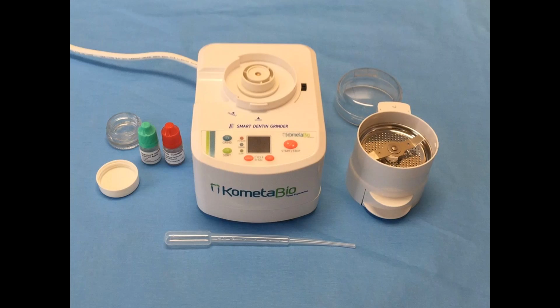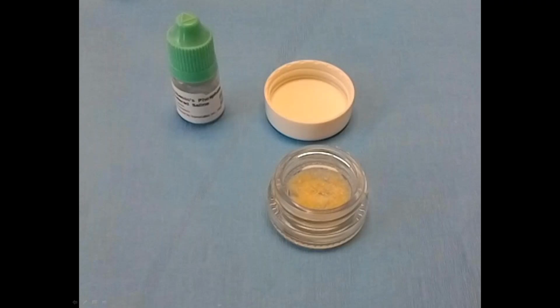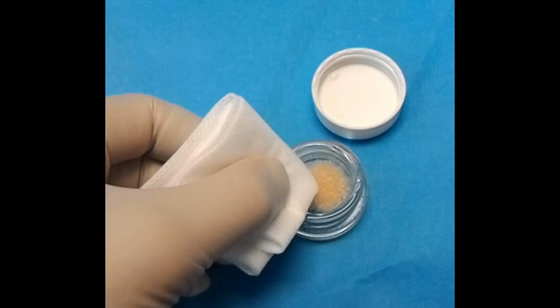Additional graft cleanser, we'll put these in the cleanser for about 10 minutes. And then once the 10 minutes are over, we use phosphate buffer to go ahead and remove any of that chemical agent off of the graft. So we'll usually wash it twice and blot any excess moisture.